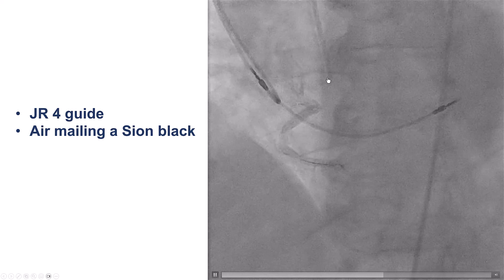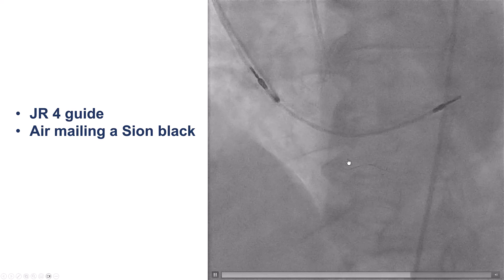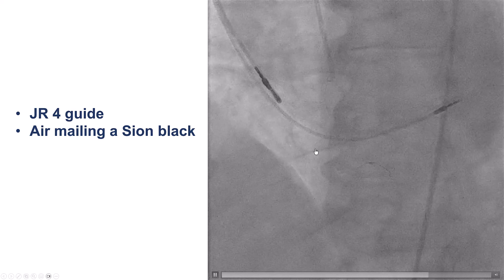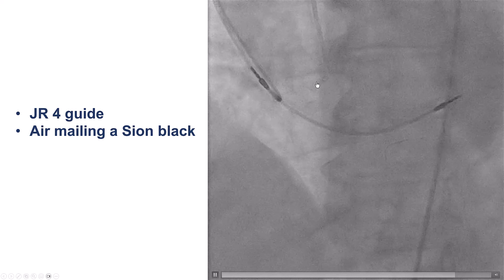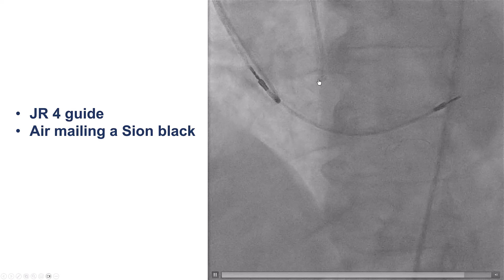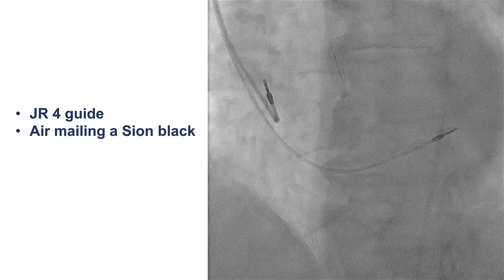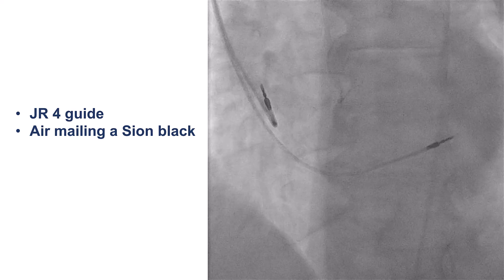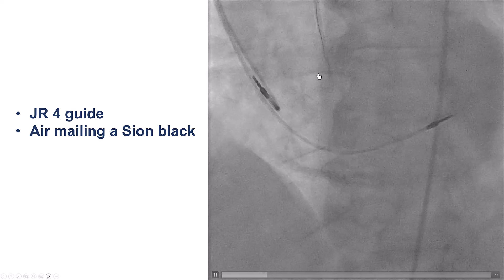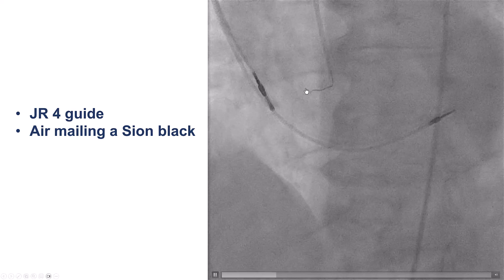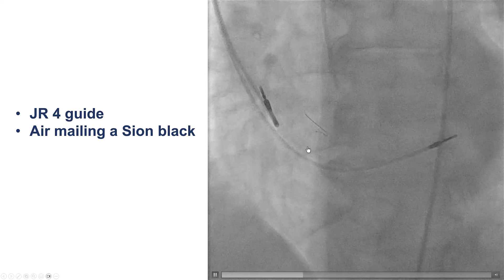Eventually, the guide wire did advance along the course of the right coronary artery. This is the airmail technique, and it is very useful when we have a lot of difficulty selectively engaging the coronary artery ostium. It is a trial-and-error technique — here we saw the success, but it took a lot of effort before getting to this point.